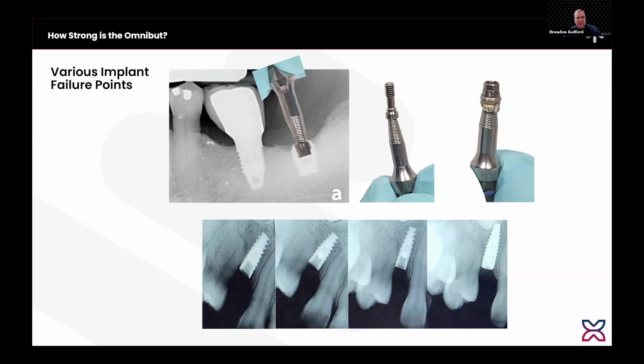So I use a fine extractor tool trying to get that fragment, and sure enough, the tip of the extractor tool breaks off in the threaded broken fragment in the implant. Well, now it's impossible to drill through. So I can't spare the implant. We back the implant out and place a new implant. This is the patient's fourth attempt at this implant. She's super frustrated.